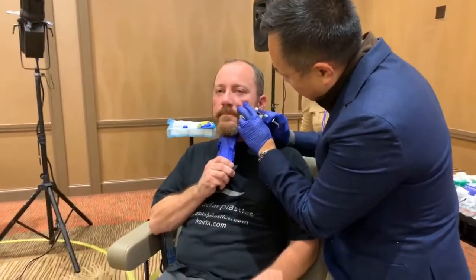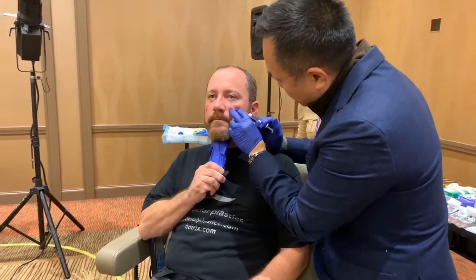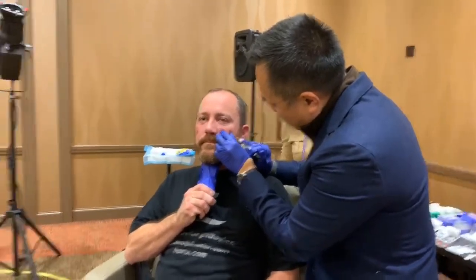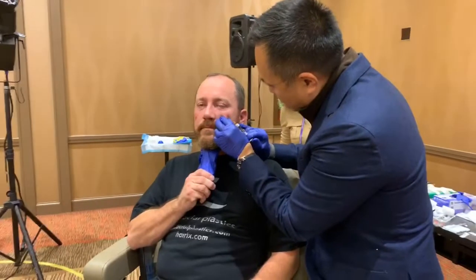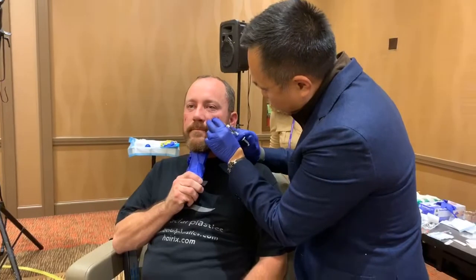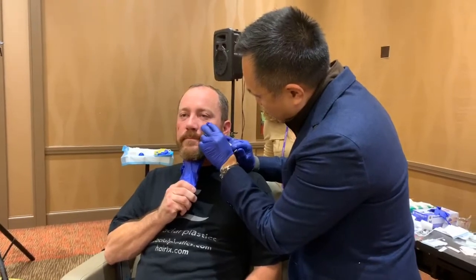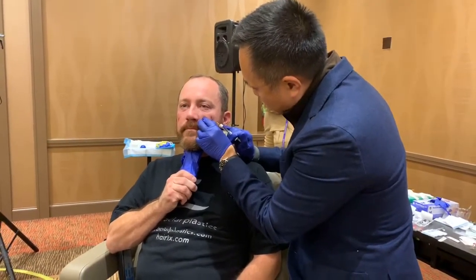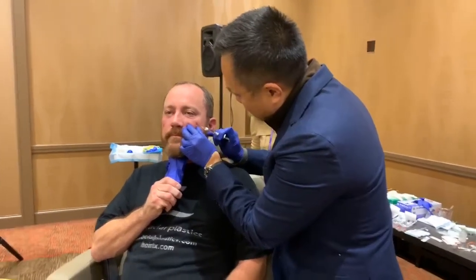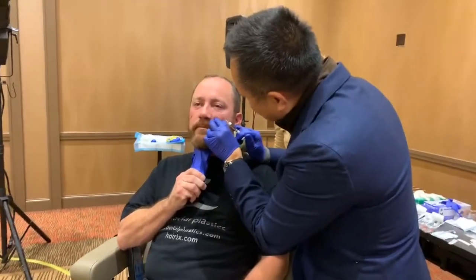This is Restylane — no financial affiliations with any companies. I prefer Restylane periorbally because it will not cause the hydrophilic response that Juvederm does. Beyond that, there are just a lot of things I like about the Galderma product line. The trade-off is the product is firmer, especially Restylane Lyft, and I tell my patients they're going to feel more firmness.